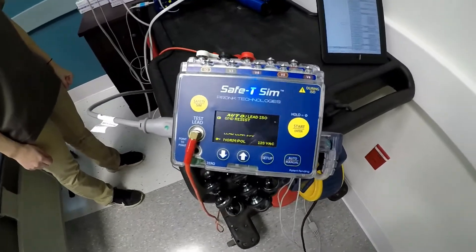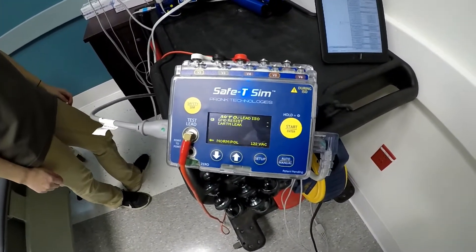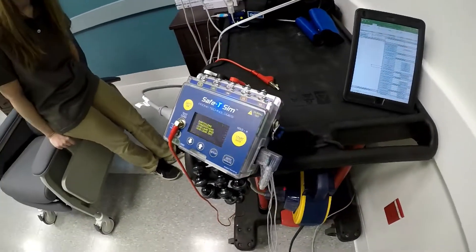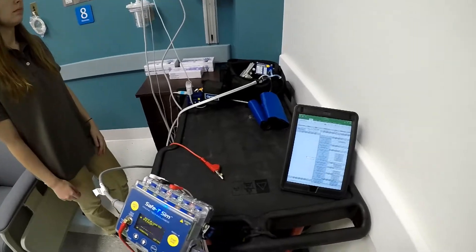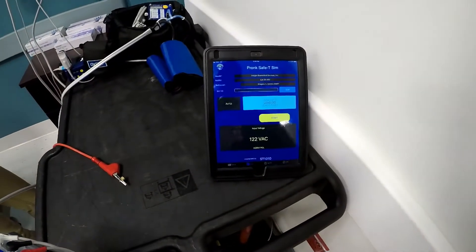The Safety Sim by Pronk Technologies is an all-inclusive electrical safety analyzer and simulation EKG, and it's Bluetooth. There is an app that it communicates with.